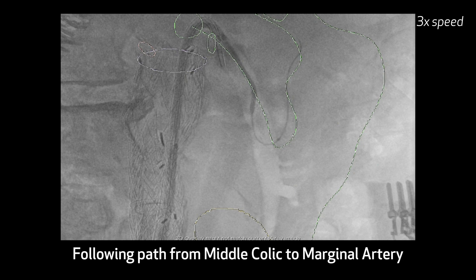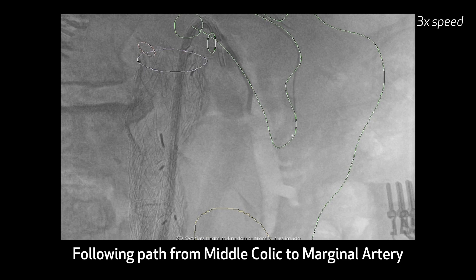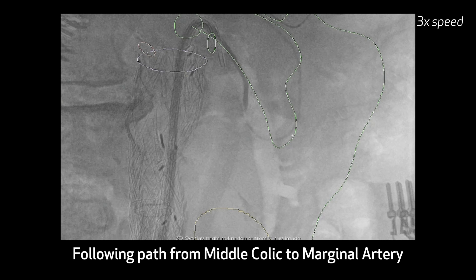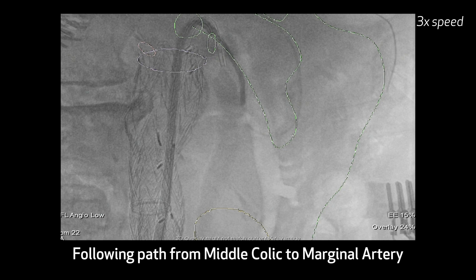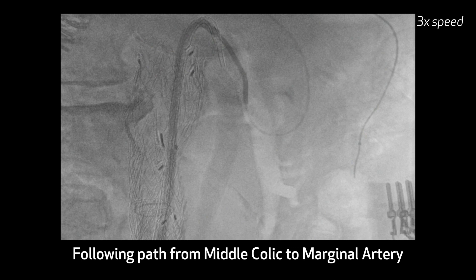Once we've done that, we will engage the middle colic artery with the Berenstein, and then using the combination of a microcatheter and an 0.014 wire, we'll navigate along the marginal artery of Drummond towards the origin of the inferior mesenteric artery. You can see that the path which was outlined off the CT scan — there's some deformity when you put catheters inside it, but it's remarkably accurate.